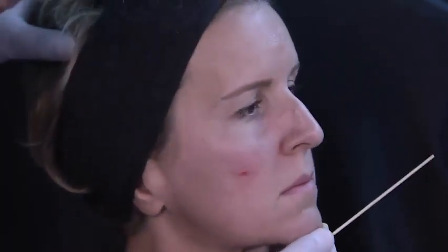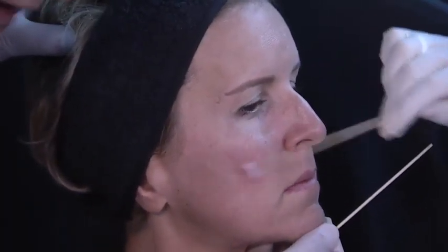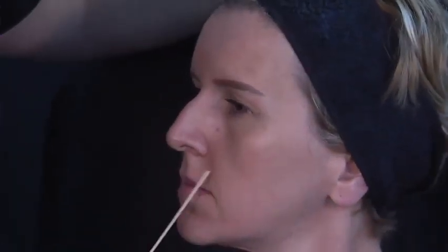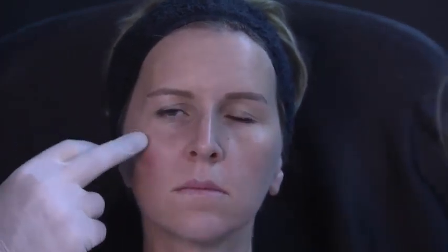Okay, we can see the nasolabial fold, it's almost corrected. And in this area, we can see the nasolabial fold, which is deeper here. And it didn't take you so much product to correct that. Well, I did inject 1 ml, but I did the whole area towards this zygoma. Okay, so we can see a nice Ogee curve here now. Absolutely. You can see that Ogee curve.